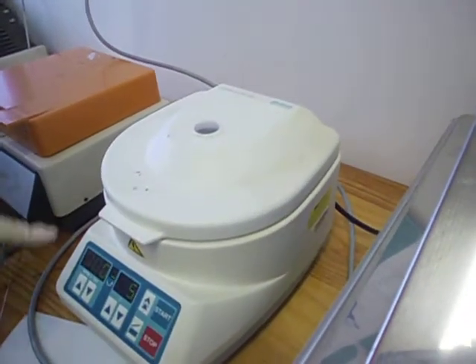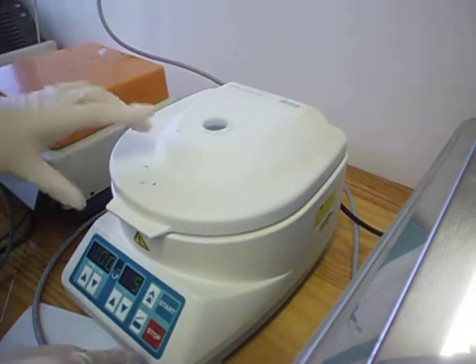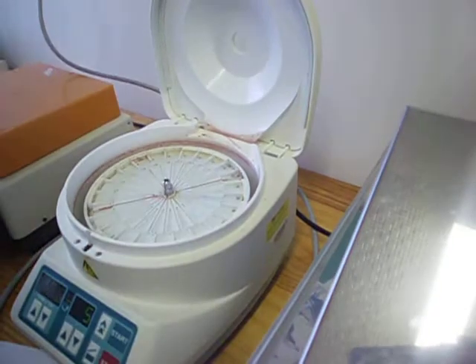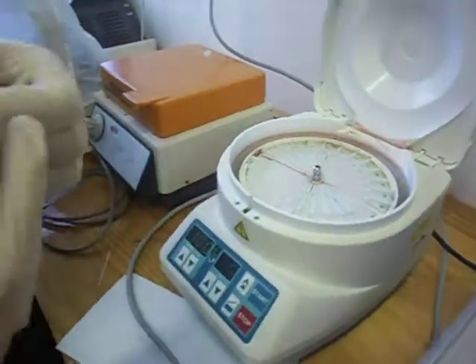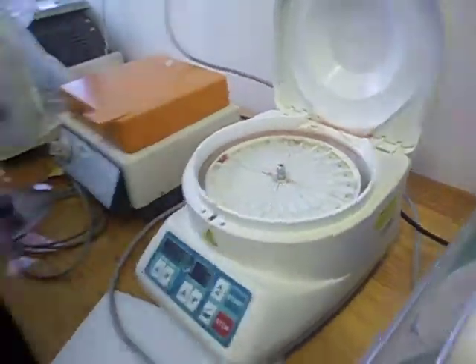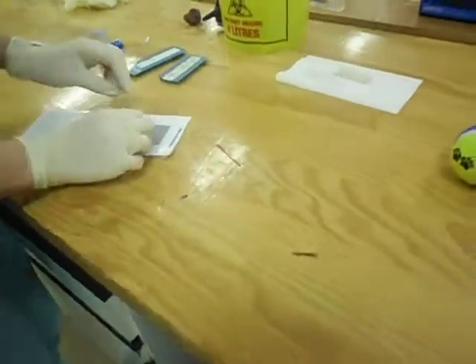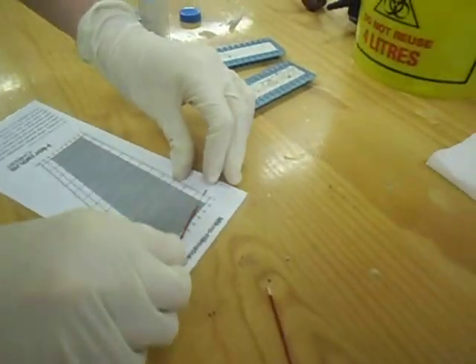Put it in and spin it. After five minutes I'd open it, and then make sure I read both of these, and then measure it on the scale for when the serum meets.